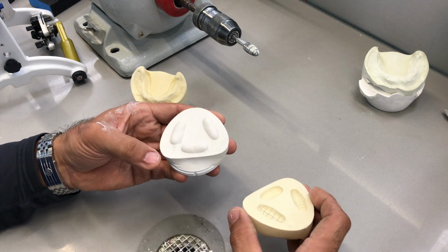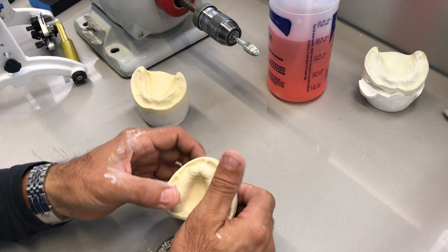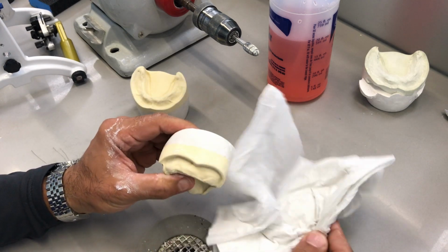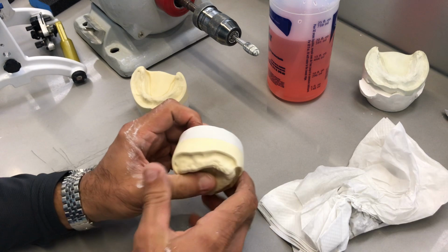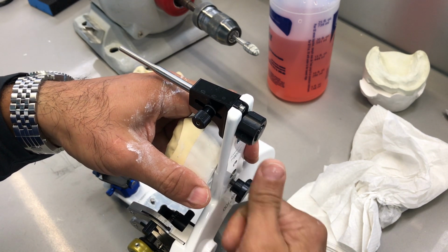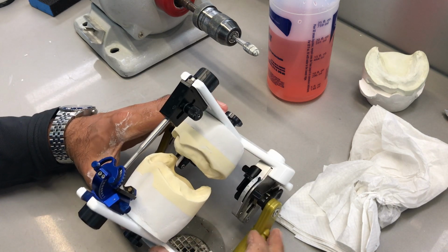This is very important. So what I'm going to do next, I'll set my model off to the side. I'm going to get a little bit of separator, apply it, and then from here on, I'm going to squeeze the model very firmly against the mounting. And you can see the excess separator seeping out the sides. I'll wipe off the excess. We'll let this dry for a couple of minutes. And now this model is secured to the mounting and we're able to use it. So I'm going to put things back on the articulator.